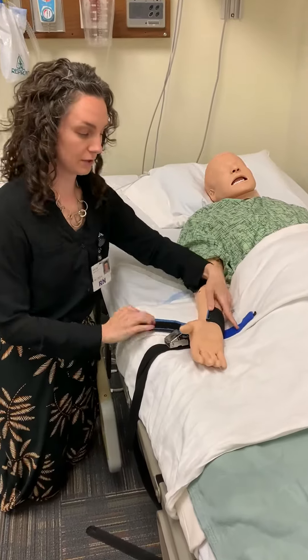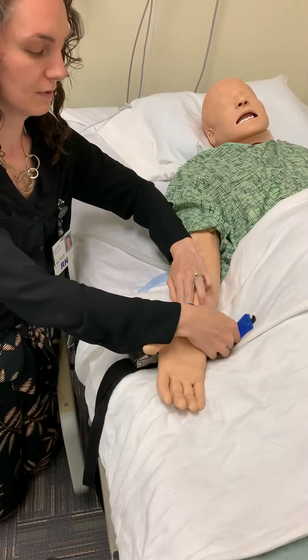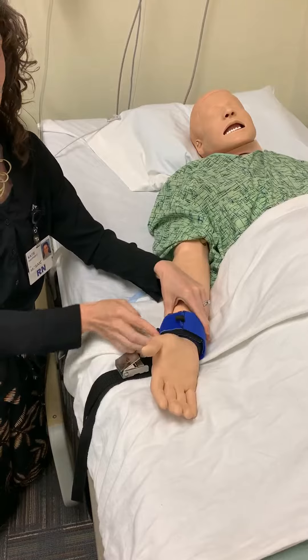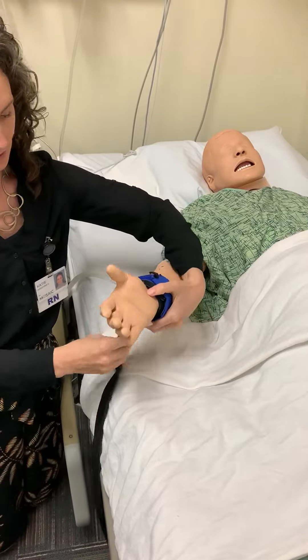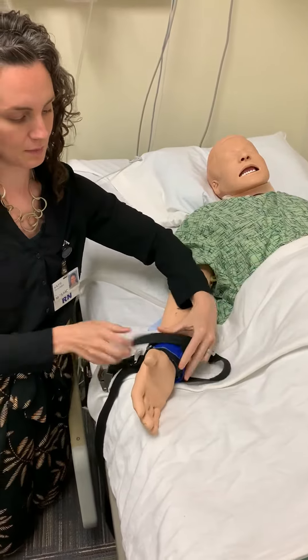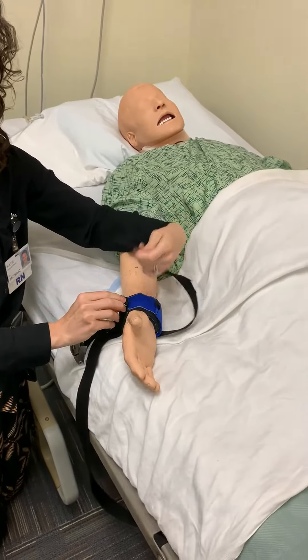From there, you just match up the colors. So black Velcro to black Velcro, blue Velcro to blue Velcro. Make sure you can get a couple of fingers in here so that you have good circulation. Then there is a skinny strap here that goes across the top, and you're going to thread this through both and then back through one.